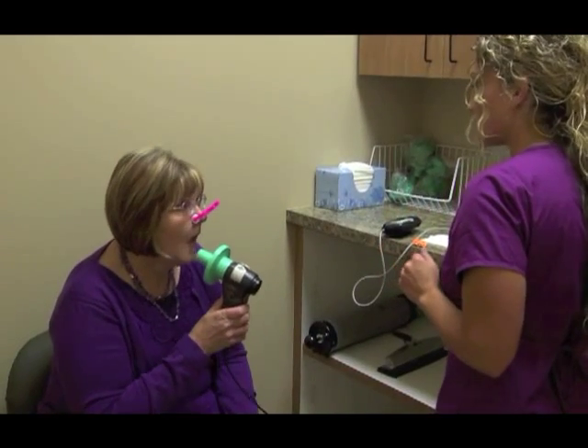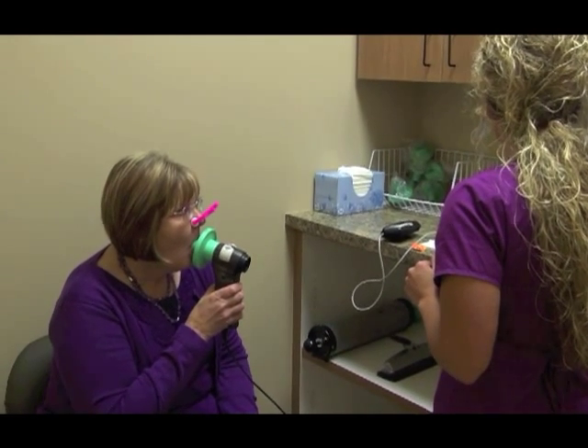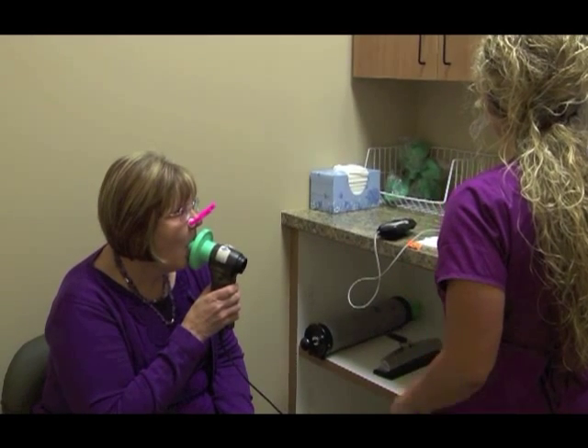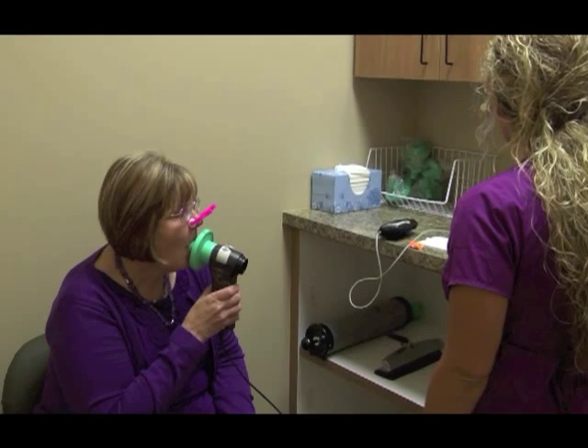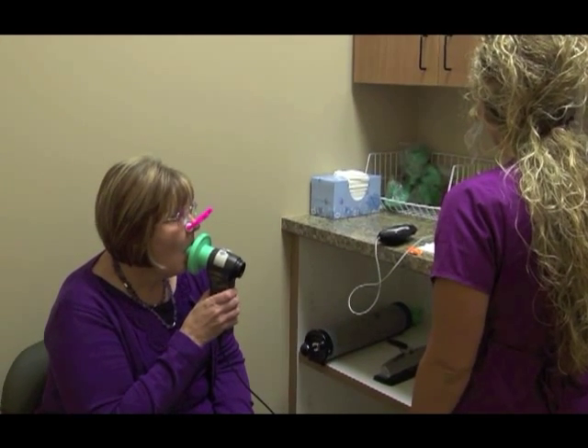Go ahead and place it in, past your teeth, starting with the two regular breaths. In, and out. Another regular breath, in, and out.